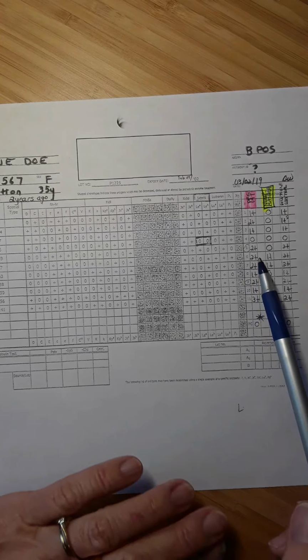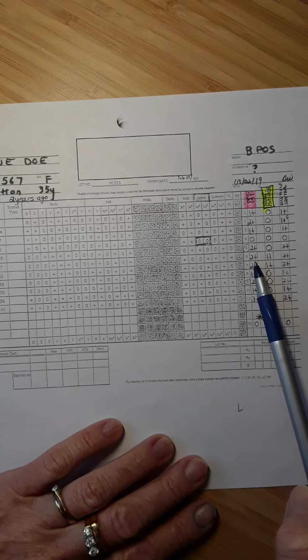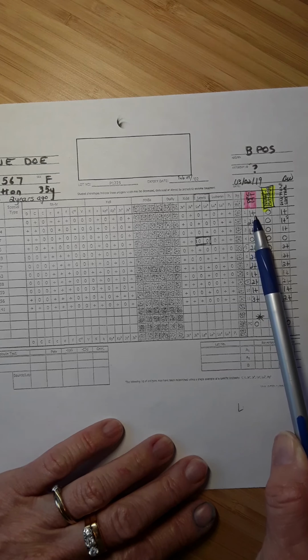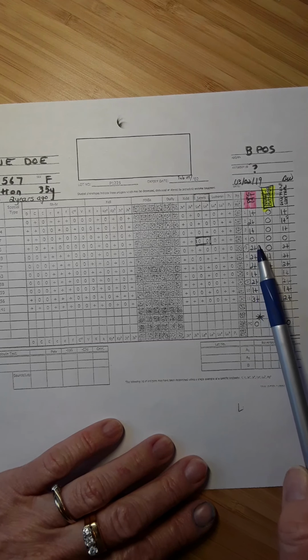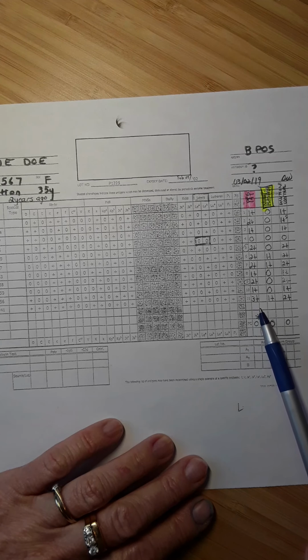And you can look at the results and see that I've got reactions in almost every tube of the 11 tubes. So I've got reactions 1 plus, 2 plus. Oh, there's a negative reaction. I've got another 1 plus, and I've got this 3 plus down here as well.